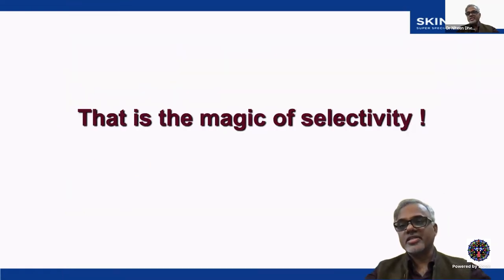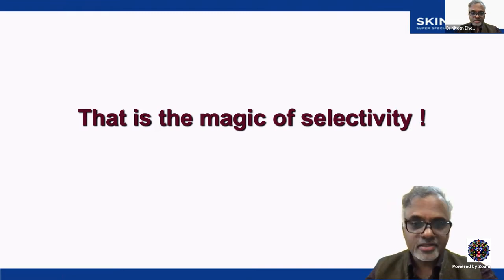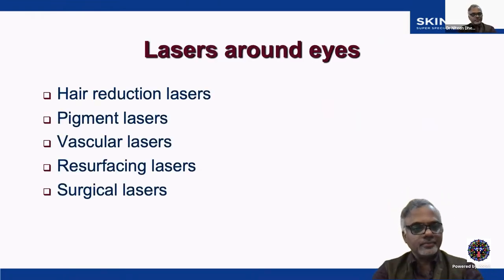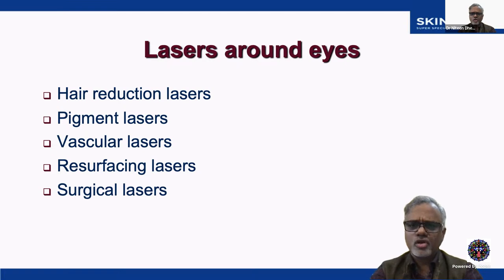So with this, the basics of laser physics, we go to the clinical application of lasers around the eyes. There are hair reduction lasers, pigment lasers, vascular lasers, resurfacing lasers, and surgical lasers. You can classify the lasers as per their use, their clinical indications, or their mechanisms.